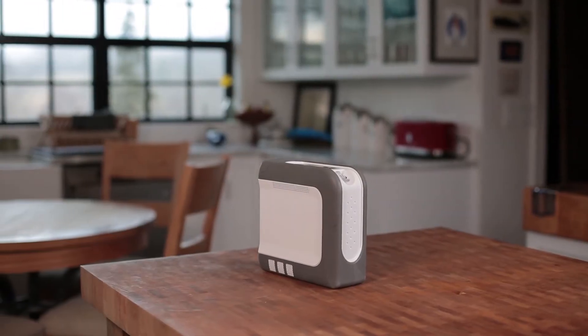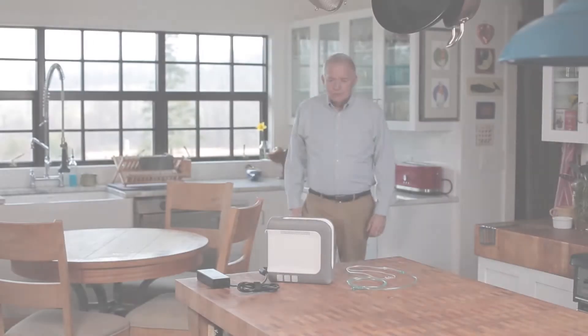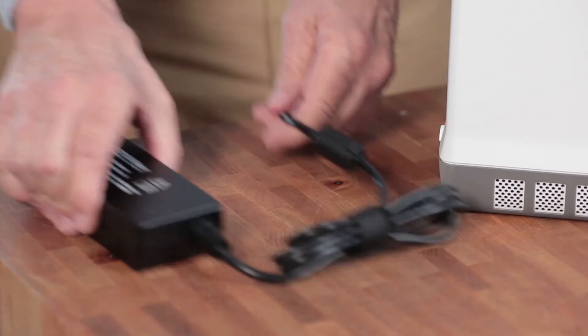Welcome to the startup and daily operation video for your iGO2 portable oxygen concentrator. Remember, before using your iGO2 on battery power for the first time, the battery needs to be fully charged.